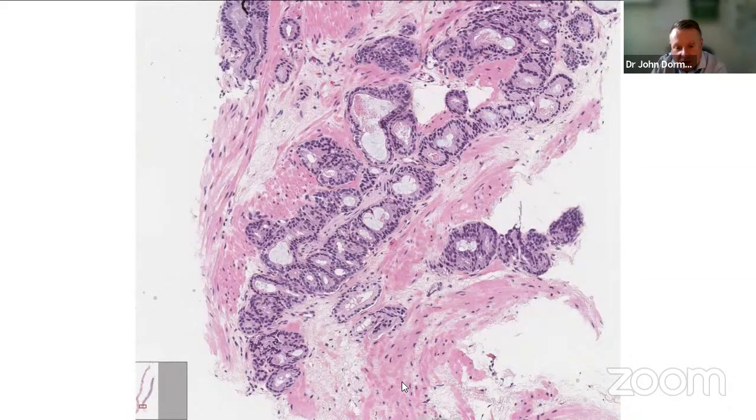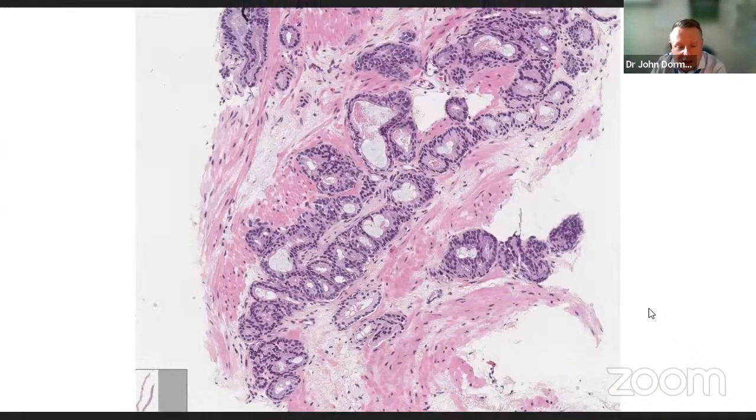There's some glands traversing through the fibromuscular stroma. Again, you wonder about some fusion. That's a bit more difficult in these long trails that are cross-cut with a lumen cutting in and out. It's quite easy to mistake that for fused glands if you don't have levels to look through to make sure that's not the case.